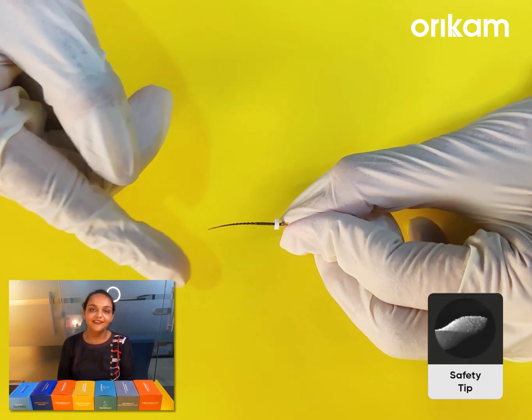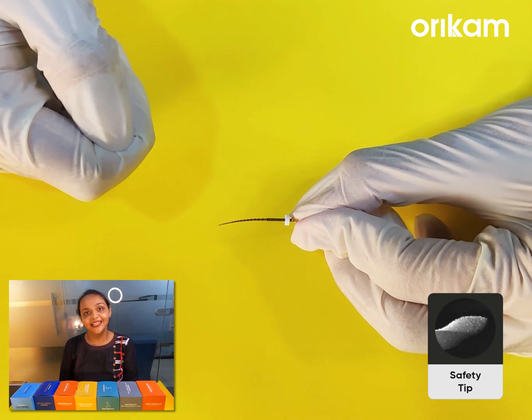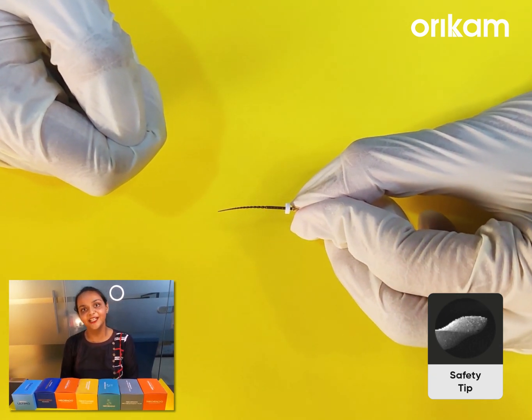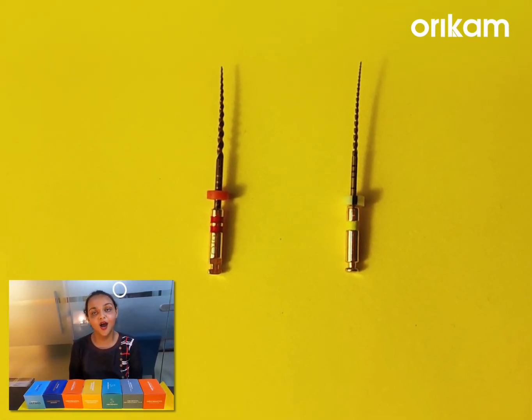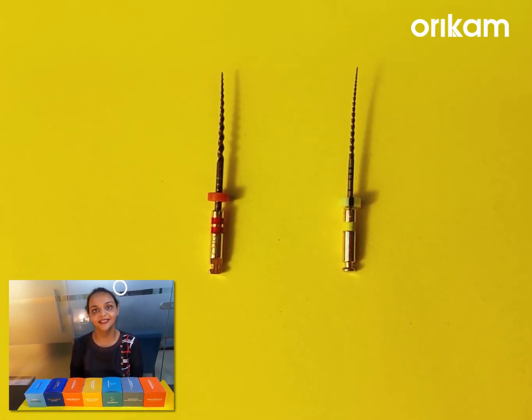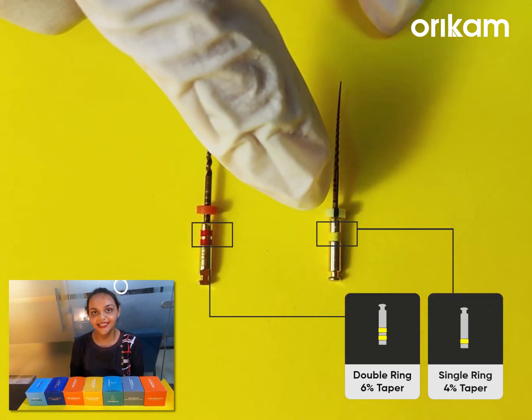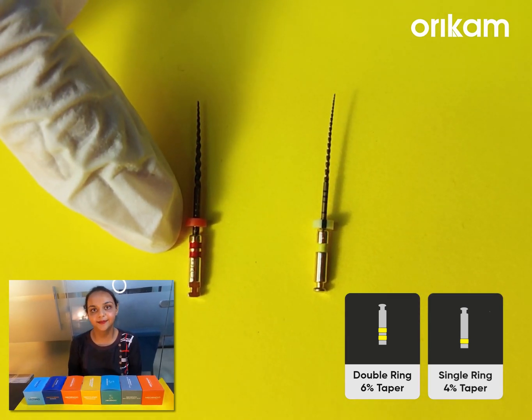The third important parameter that we need to consider is the tip of the file. It has a safety tip, which minimizes the risk of transportation and ledge formation. A lot of doctors have been asking us how to differentiate between the 4% and the 6% taper. A single ring on the shank of the file indicates 4% and two rings on the shank of the file indicates 6% taper.